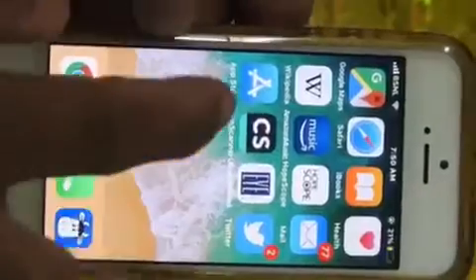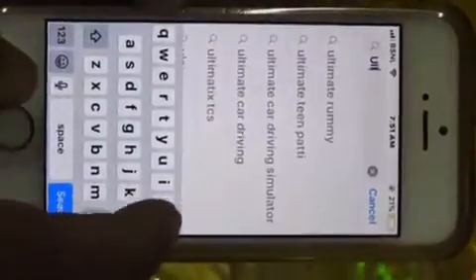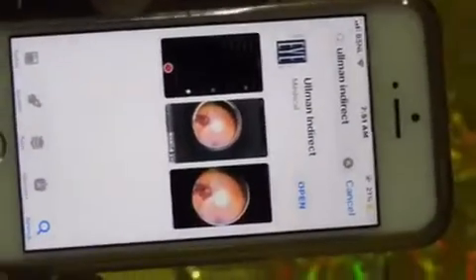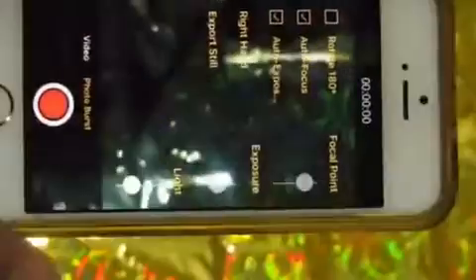It's all ready for use. Now open the app store or the play store on your mobile phone and download the Ulman Indirect app. Open the Ulman Indirect app and fill the full screen of the mobile with the 20 diopter or the 28 diopter lens by zooming the image of the lens.